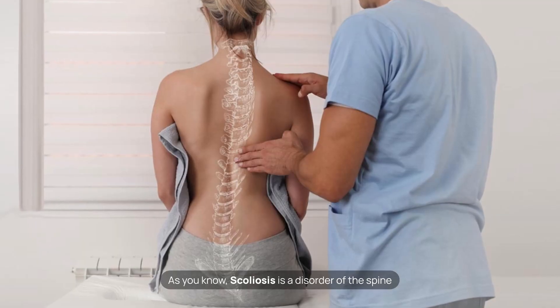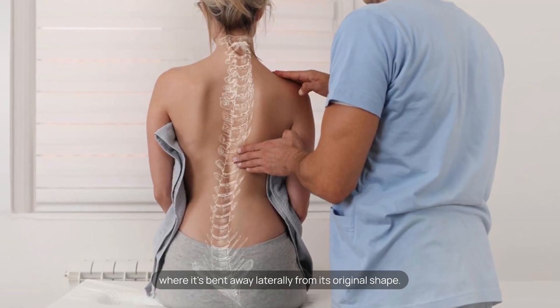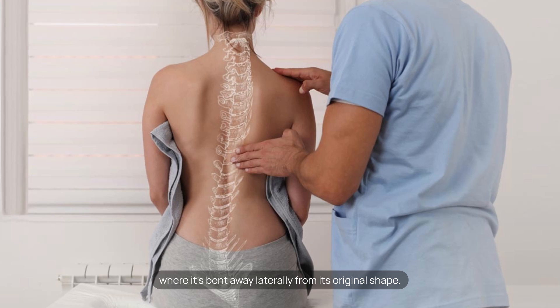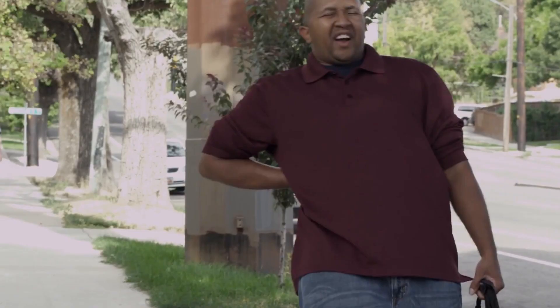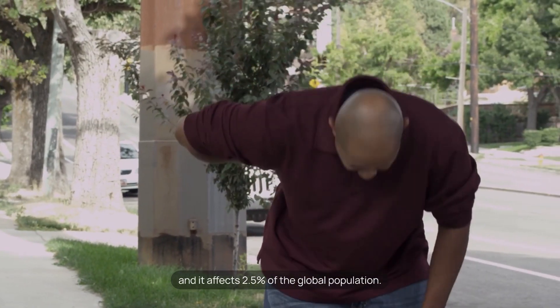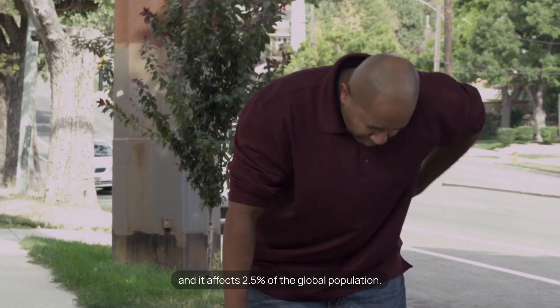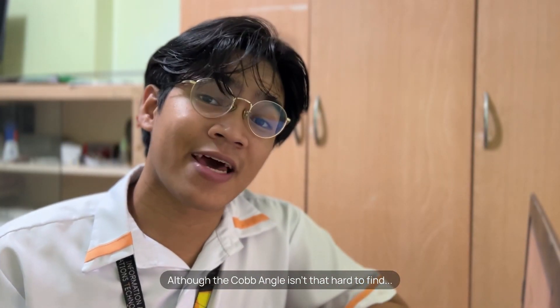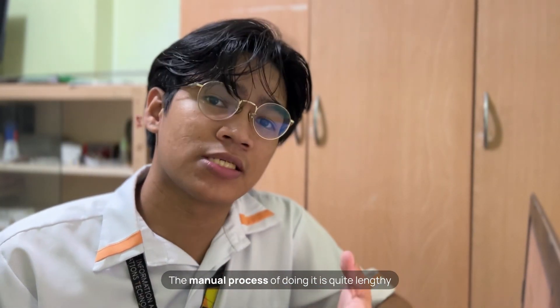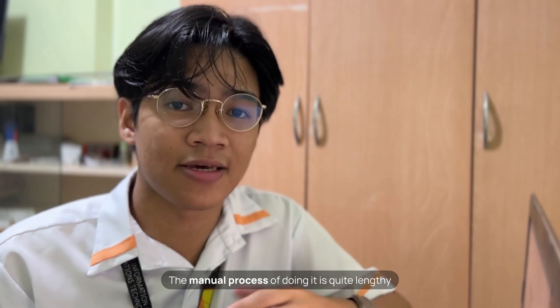Scoliosis is a disorder of the spine where it's bent away laterally from its original shape, and it affects 2.5% of the world's global population. Although the Cobb Angle isn't that hard to find, the manual process of doing it is quite lengthy.